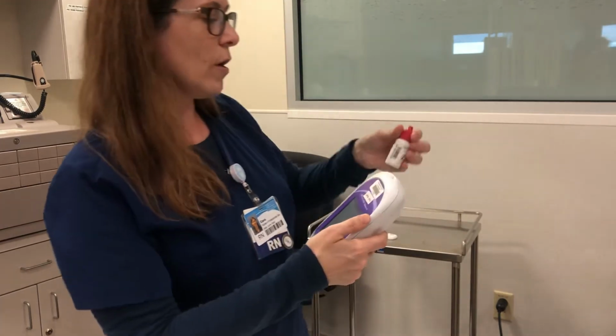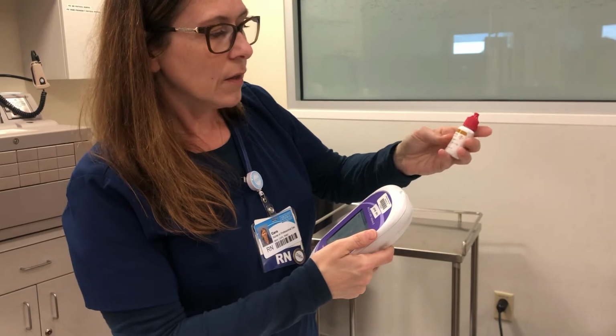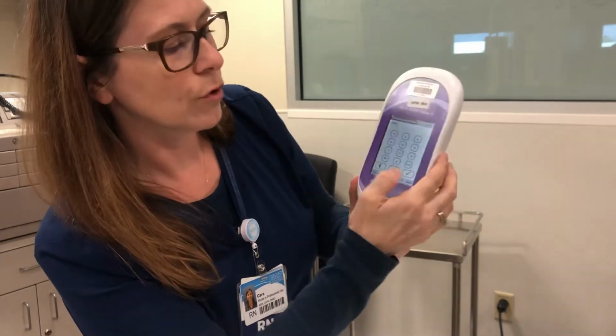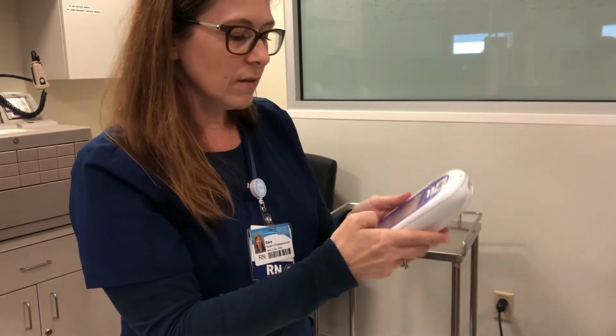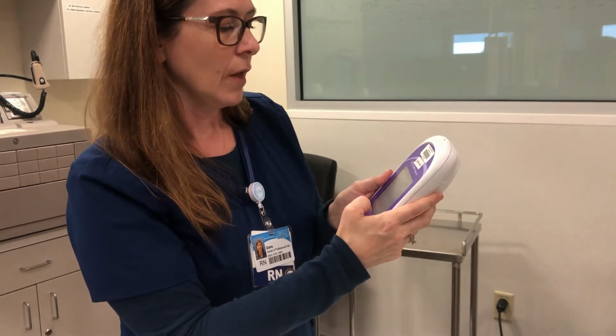So for our positive, this is our positive. It's a level 2. The lot is 73842, and it reads 73842. So I'm just going to hit OK. If it was a new lot, you would manually enter that in. The date tested is today. The time tested is now.